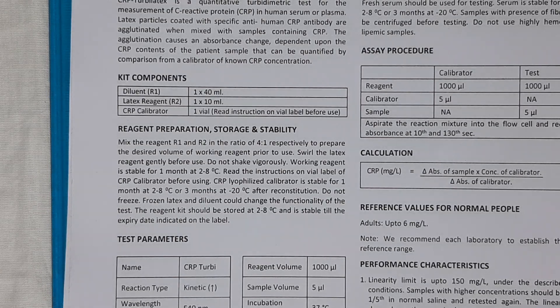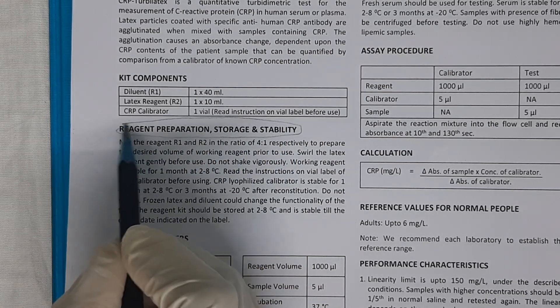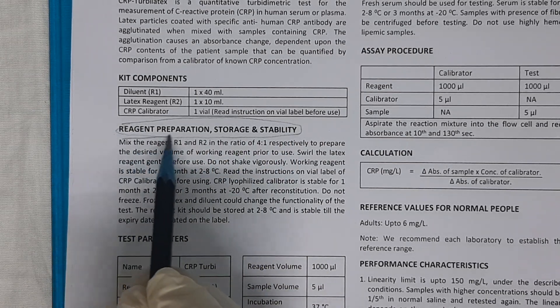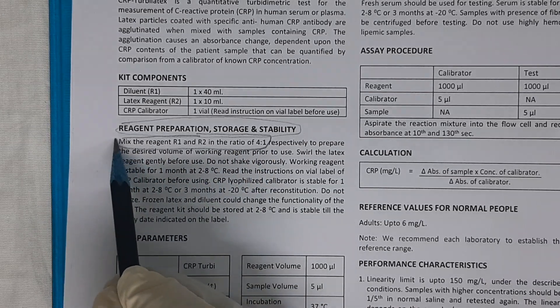Before looking at the procedure, let us understand how to prepare the working solution. To prepare the working solution, you need to take 4 parts of Reagent 1 and mix it with 1 part of Reagent 2.